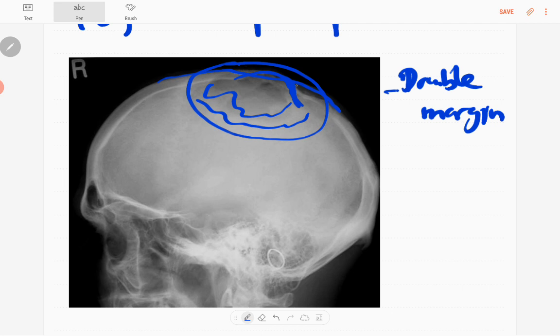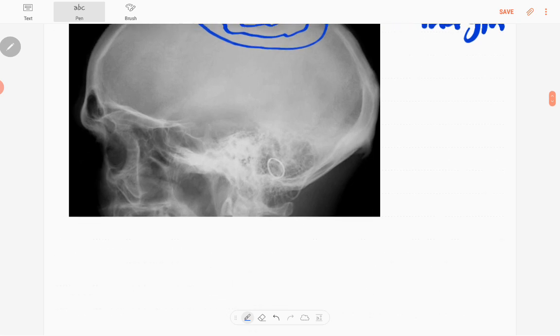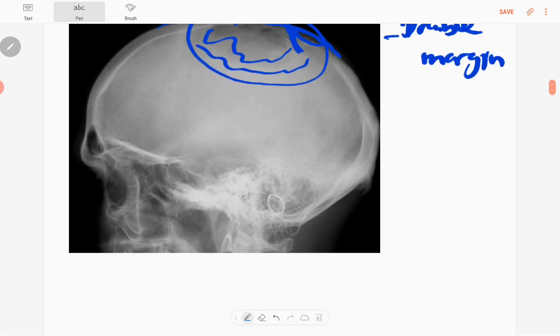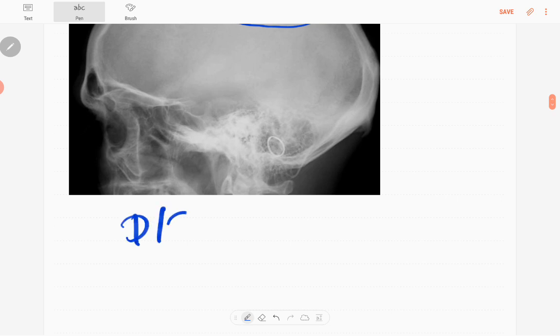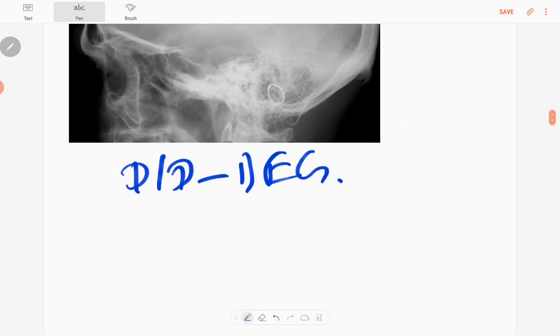There's another lesion in this region. Apart from that, no other lesions as well. So the differential diagnosis is eosinophilic granuloma, number one. Second one is leptomeningeal cyst.